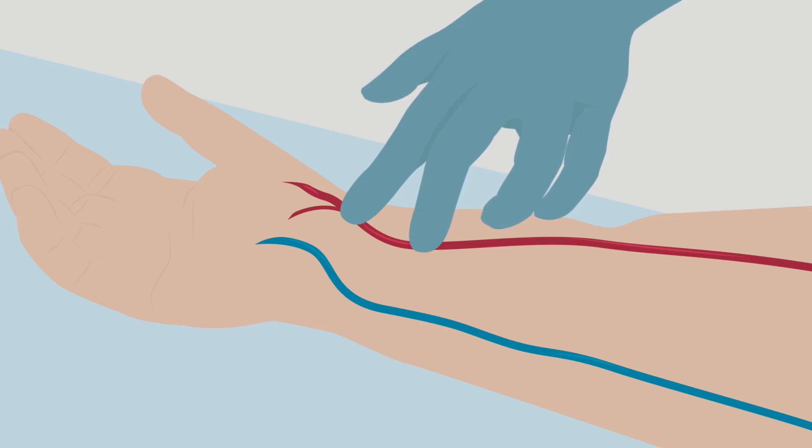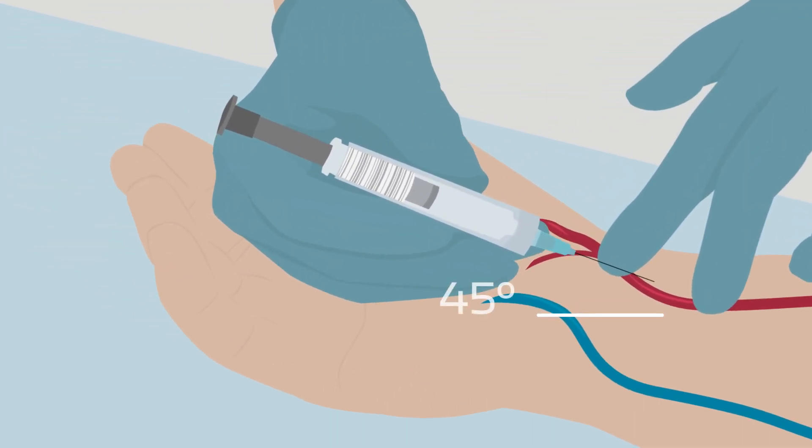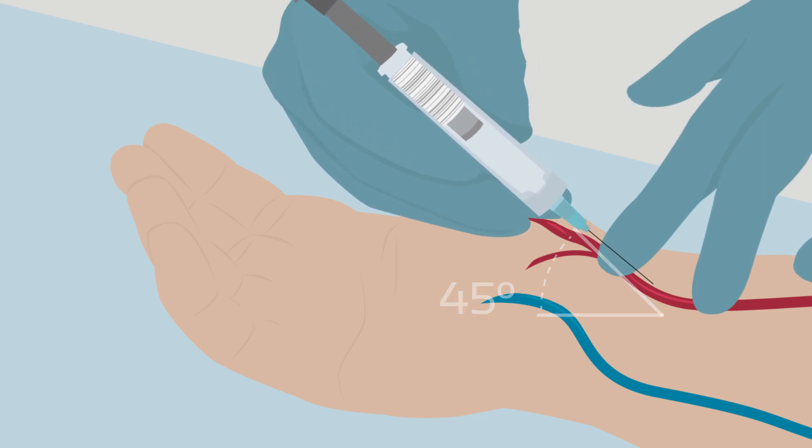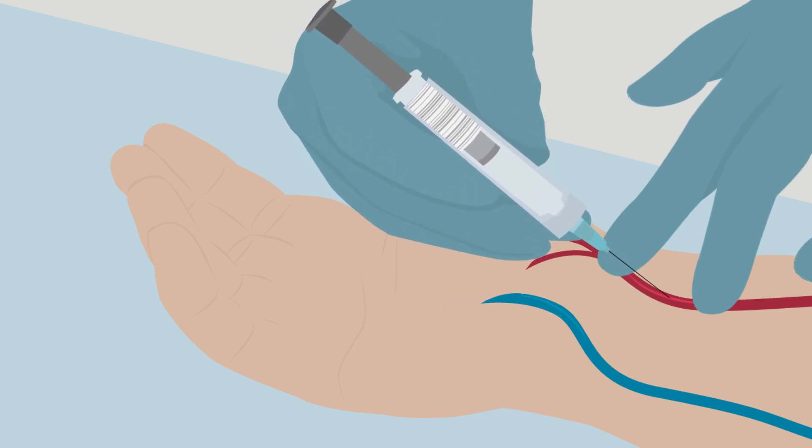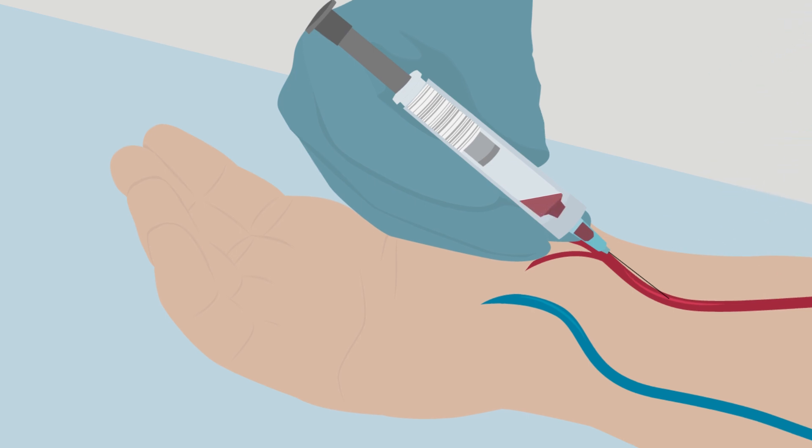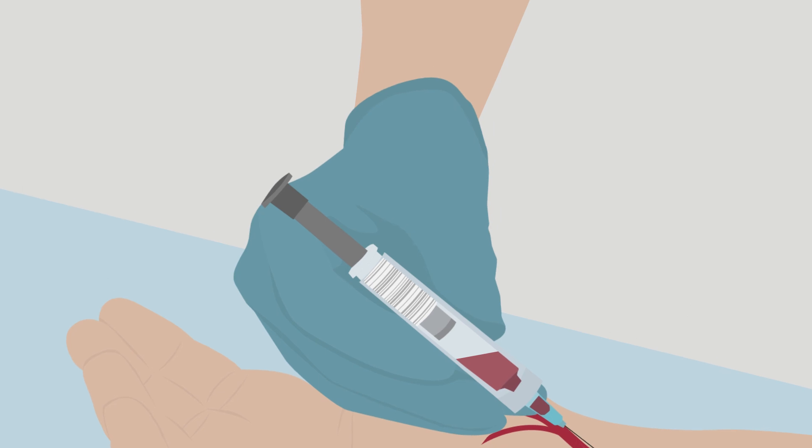You can use your index and middle fingers to identify the path of the artery. Hold the needle at a 45-degree angle or less and puncture the skin right in front of your index finger, making sure that the needle insertion follows the path of the artery. Stop the insertion when you see a flash of blood entering the syringe, and hold the position until you have collected the desired blood volume.